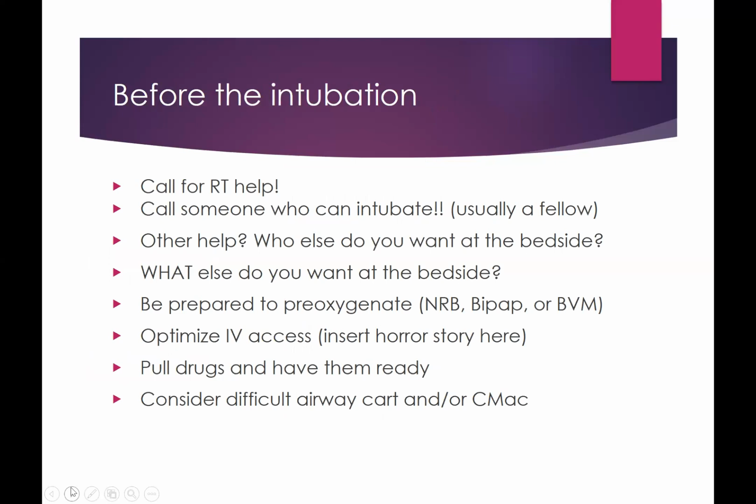So, of course, before we intubate, we definitely want respiratory therapy in the room. They are our best friends. I, for many years, relied very heavily on respiratory therapy to help me figure out what was going on with a lot of patients. They are the experts. And who else needs to be at the bedside? If I am a nurse and I've never been in an intubation, I would like somebody who's a little bit more experienced in this scenario.